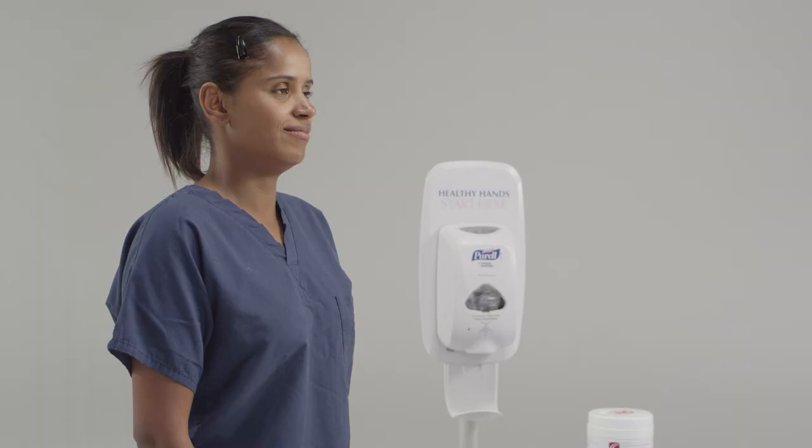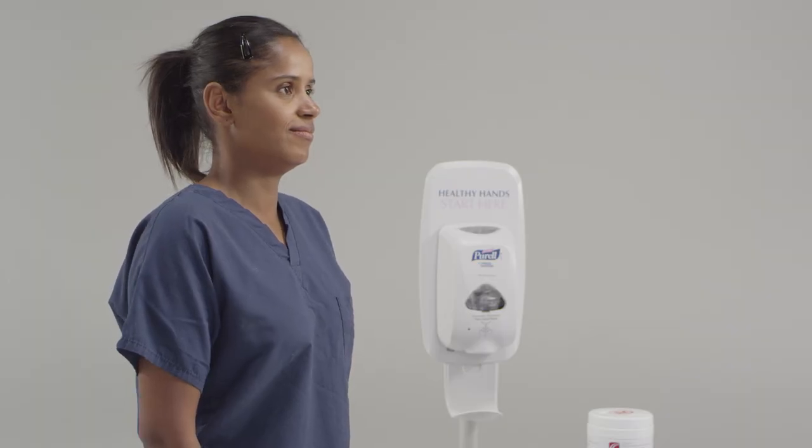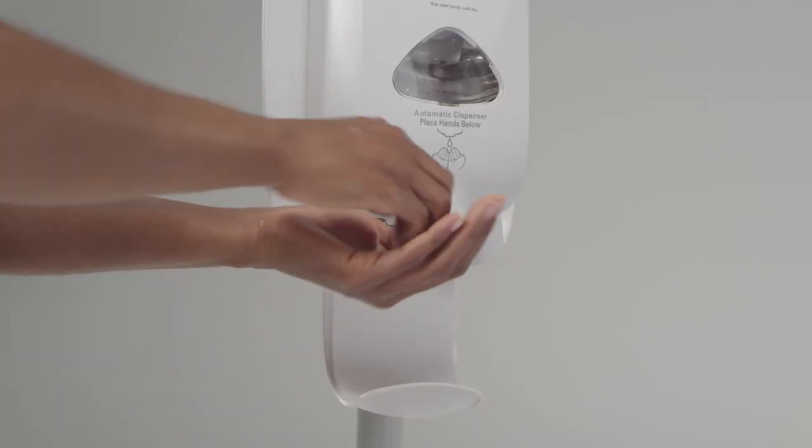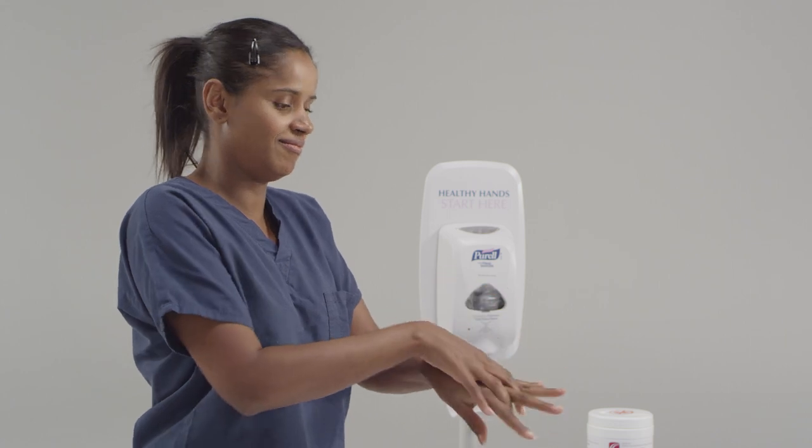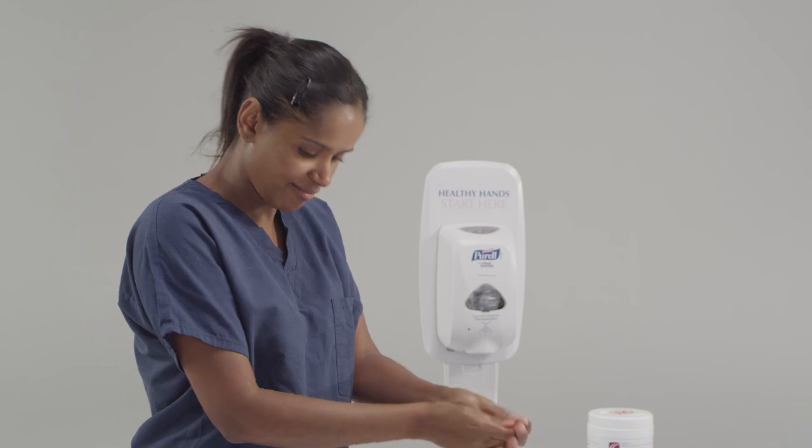Before we do any kind of procedure, we're going to do proper hand hygiene. Remember to do hand hygiene between your fingers and on the back of your hands and the palms, and we're going to make sure that we let the alcohol gel dry before we proceed.